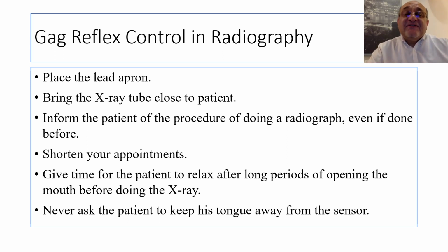Your appointments should be short, especially for endo, where we face the gagging most. Long procedures for the patient can make him less cooperative. So please try to shorten your appointments so that you guarantee that your patient will be cooperative.